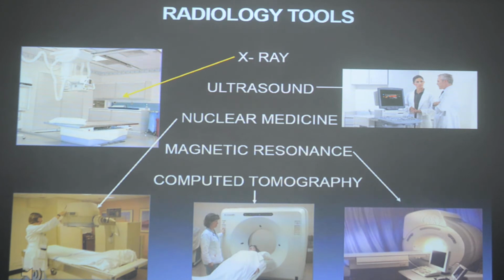Whereas MR takes 15 to 20 minutes to complete the study, and it's mostly done in those cases where you need to know more in detail, when you're not suspecting hemorrhage, or the case is planned like a tumor or an infection where you already have a scan before and you're following it up. So MR is for more soft tissue detail. CT is where you just want to rule out hemorrhage so that you can put him on anticoagulants. Clear on this?